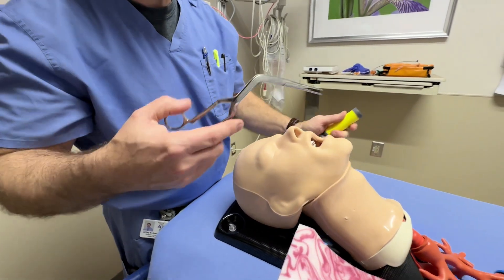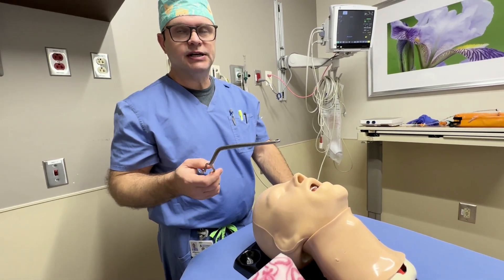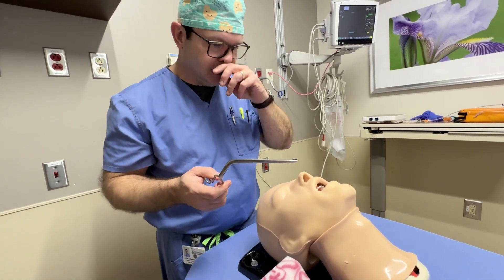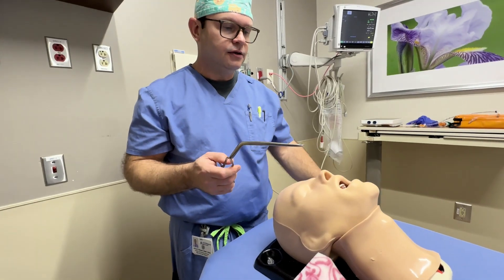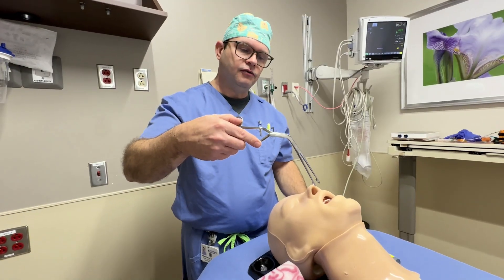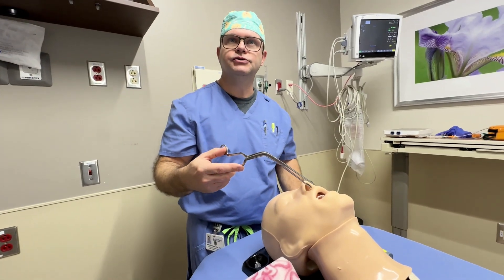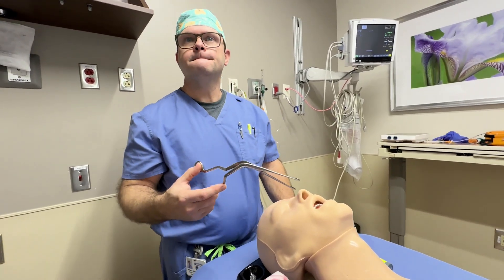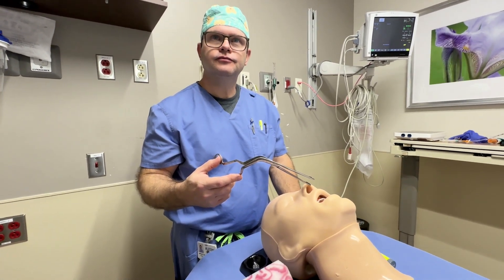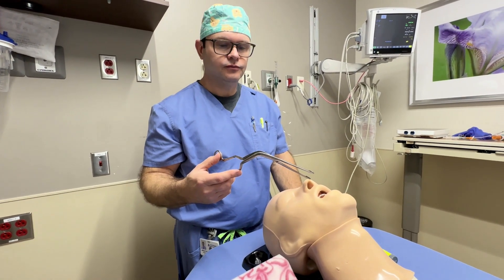Foreign body removal is one application. Another application we use in anesthesia is to facilitate nasotracheal intubation. We will typically pass the tube via the nasopharynx into the oropharynx, then perform either a video or direct laryngoscopy, and use the McGill forceps to direct the tube into the glottic opening while advancing the tube simultaneously through the nose. Back in the day, I did a lot of blind nasotracheal intubations, but McGill's is a much safer, much more assured way of making sure it's going in the correct location.